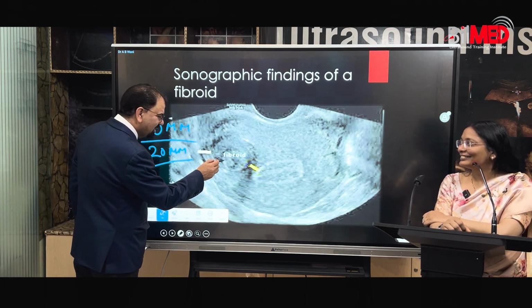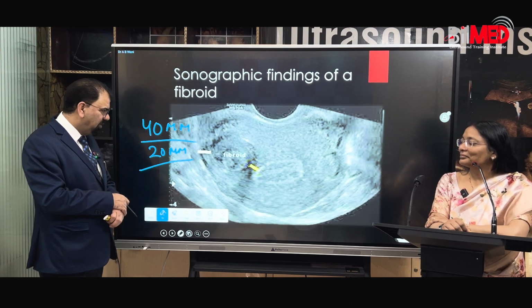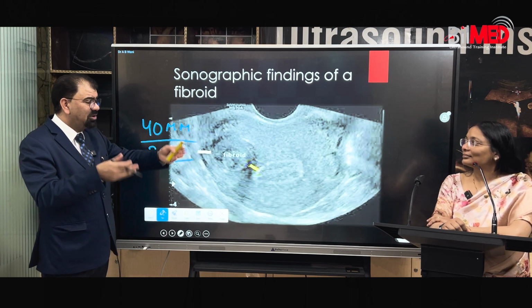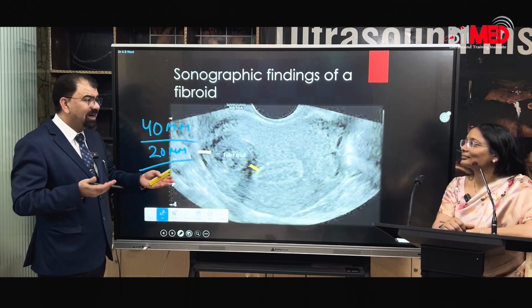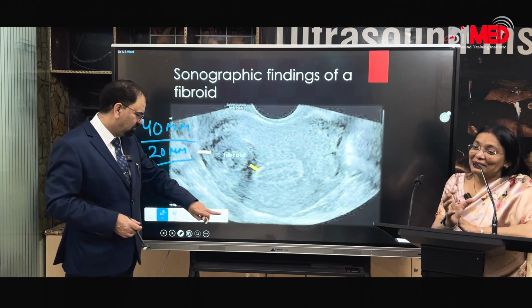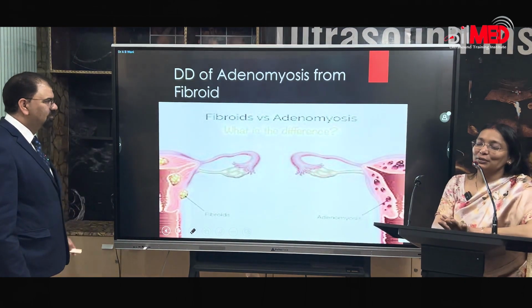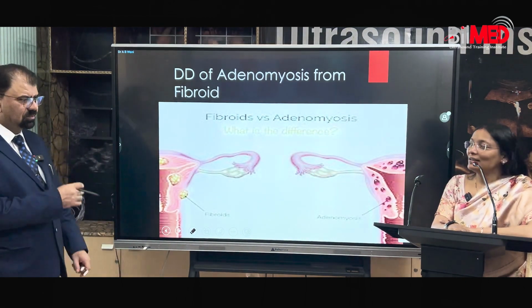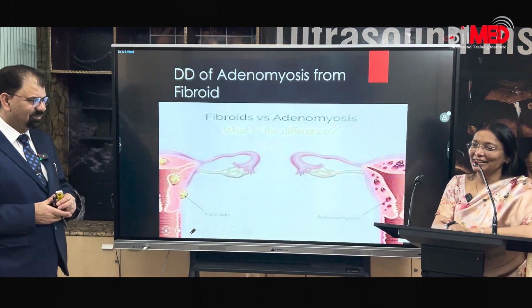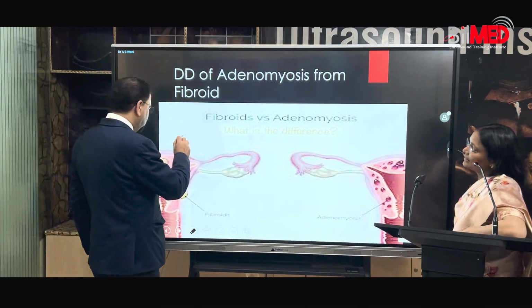Now the echogenicity was previously very high. All of a sudden you are seeing a drop in the echogenicity. You are thinking that there are some red degenerations, white degenerations overnight. That cannot happen. See, actually, this is not a theory, this is a concept which, once given, gets inbuilt in our mind. So this was like an eye opener, and now I can say I know how to differentiate fibroid and adenomyosis. So now I am leaving this question up to you.